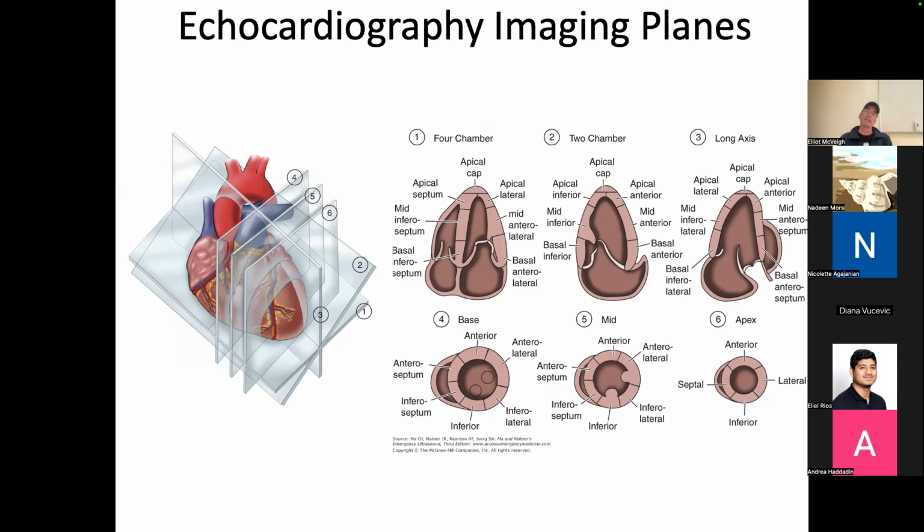So if we're looking at the echocardiography views, and you will see all of these in the report, these will be beating, and you see something, part of the muscle is very thin and not functioning very well, and part of the reason for that is it may have suffered a heart attack some time ago, it's now fibrosed, and the wall has thinned, and you want to report that. The coordinates you use are these. You say the anterior wall of the heart has been thinned, or you say the anterior and anterior septal, and that tells you this whole chunk is thinned and not functioning, right? That's how you report that out.